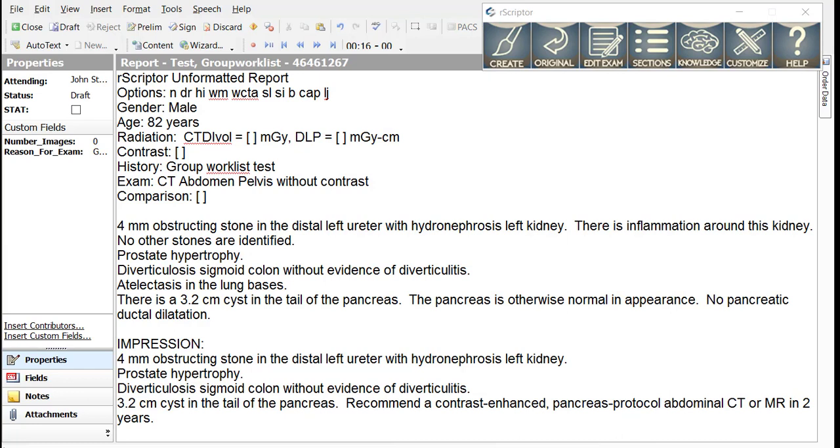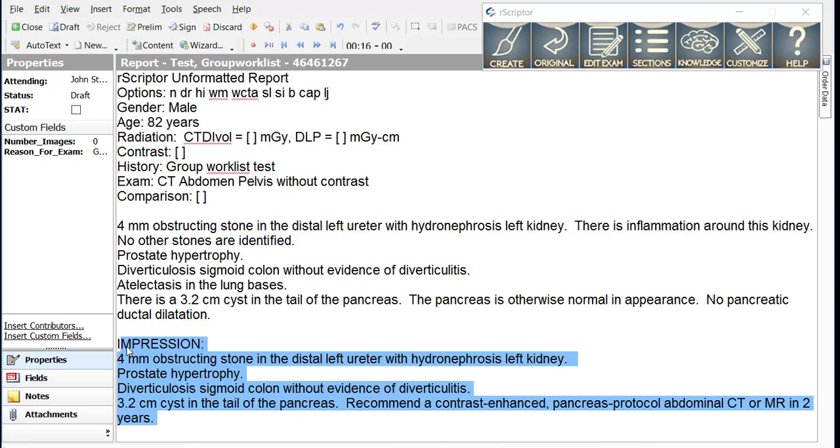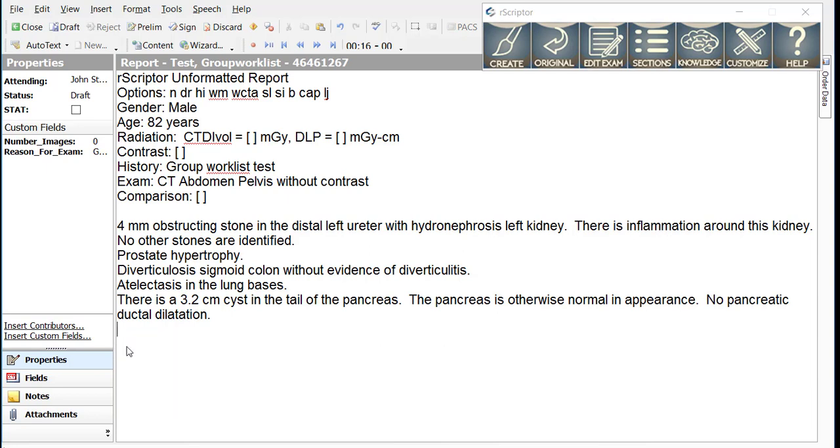Returning to our CT abdomen and pelvis report from tutorial 1, let's remove the impressions section because we no longer want to dictate this section separately within R-Scripter. Instead, we will use one of two keywords in R-Scripter that tells the program how to create the impressions section using the dictated findings.